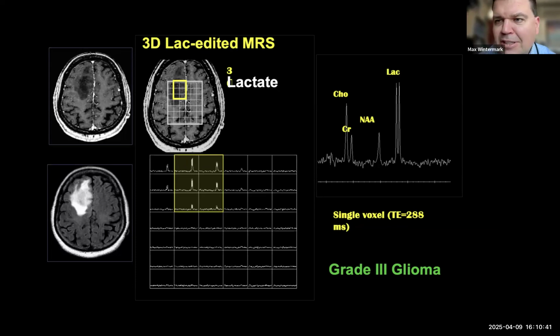But often our patients, after 45 minutes in the scanner, want to get out, they start moving, they breathe, they cough, they snore. And all of that is a lot more likely to negatively affect the quality of your 3D spectroscopy. So it's this compromise between getting theoretically better information, but being exposed to the practicality of a moving and breathing patient.